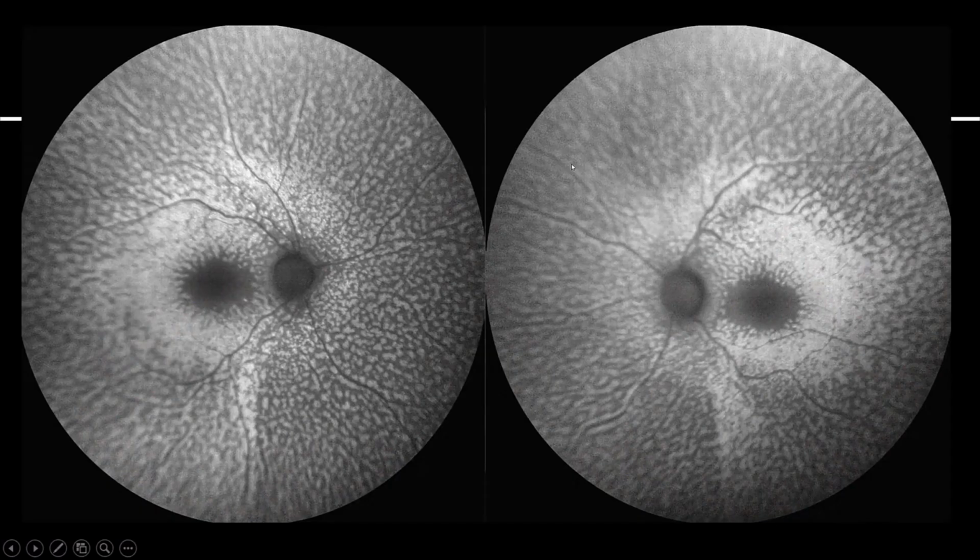So anyone can tell what this image is, what modality and what is the diagnosis? Yes, fleck retina. There's fundus albipunctatus as well as benign familial fleck retina. This is an autofluorescence image of a benign familial fleck retina. This got accepted as a cover image in Canadian journal, but the color picture of the same got accepted as a cover picture in Ophthalmology. So one patient, 2 different sets of images, 2 different publications.